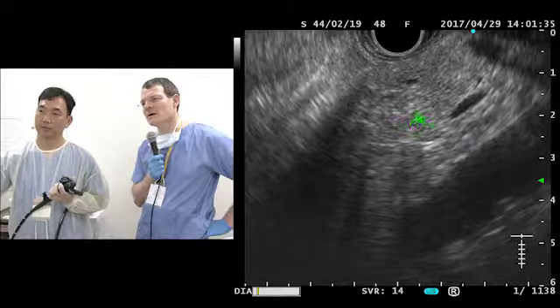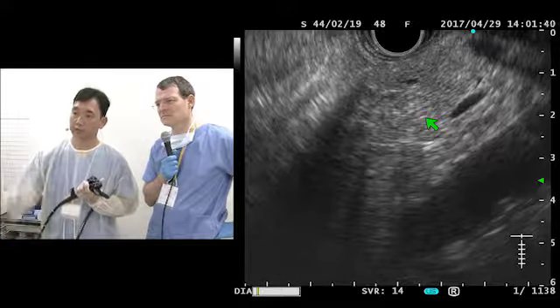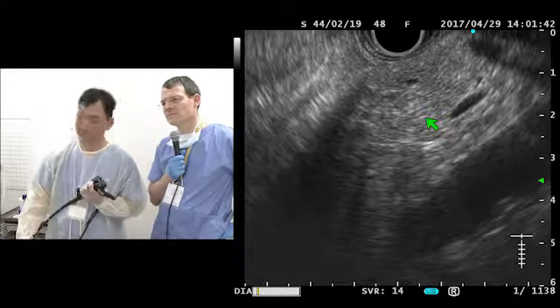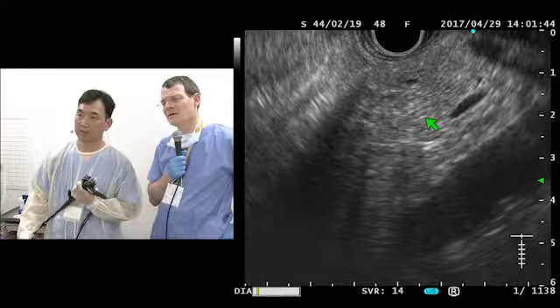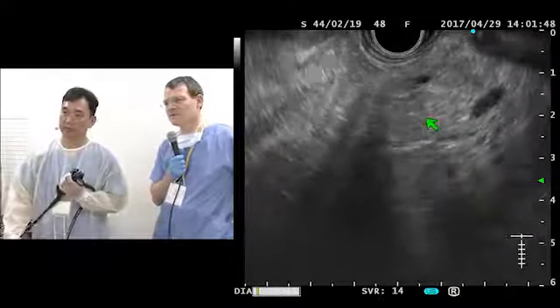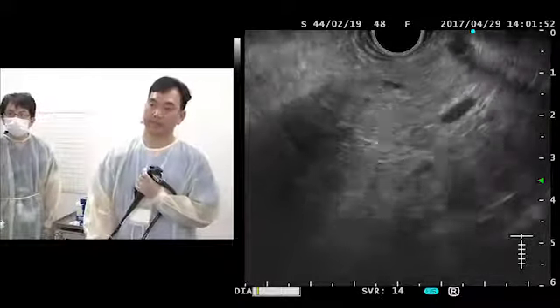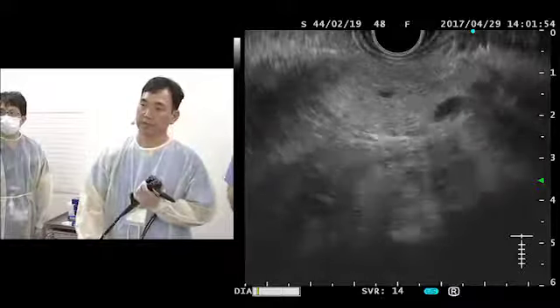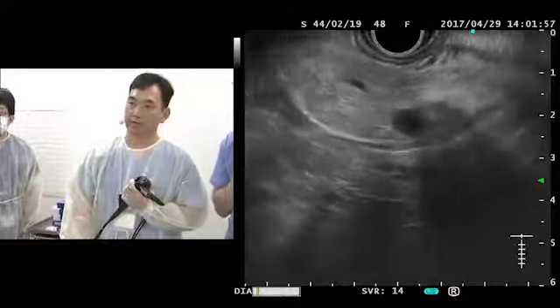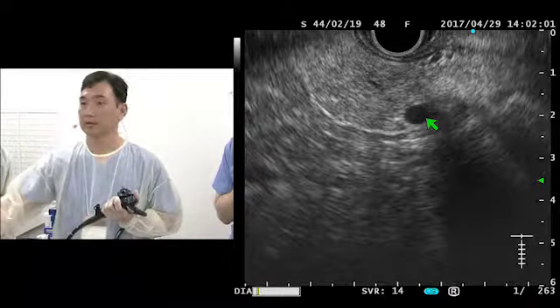some of the hyperechoic foci with the echo-poor posterior shadow. Maybe that signifies pancreas parenchymal calcification. I'm not totally sure about it, but let's keep that in mind. Yes, yep. But there's no lobularity per se. The pancreas capsule you can see is very smooth.